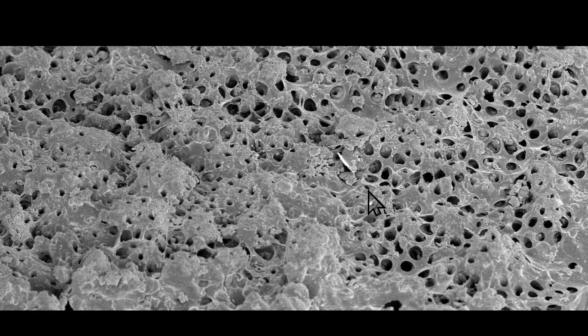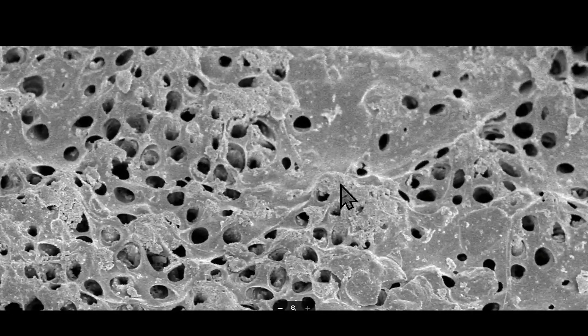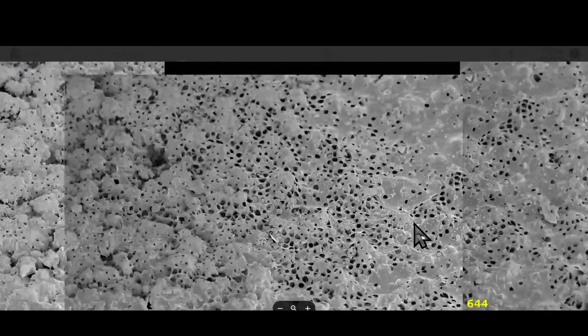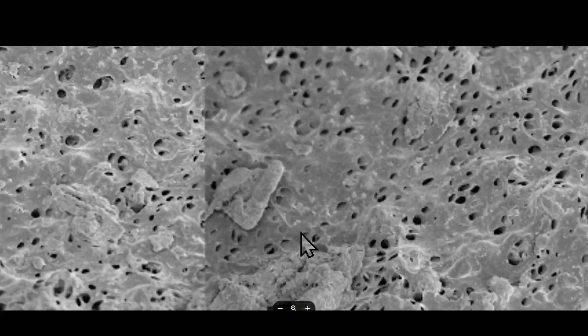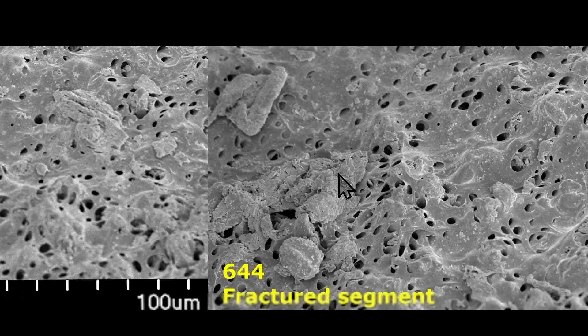The mineralized tissue has the smooth melted butter look to it. So you see a partially mineralized pre-dentin layer, and here you can see some remnants of the pulpal tissue layer, probably pulpal cells still present.